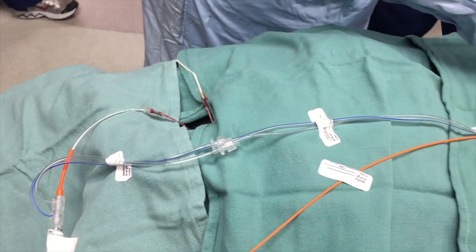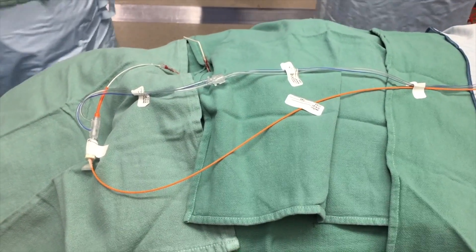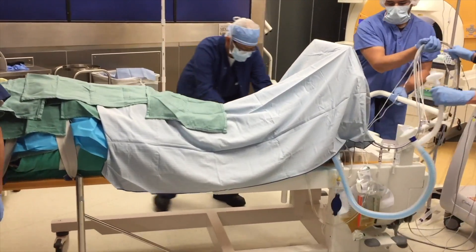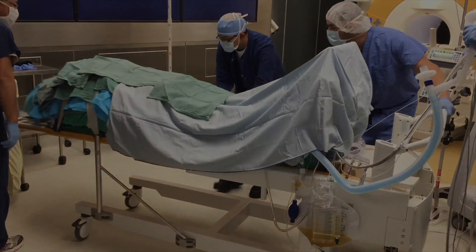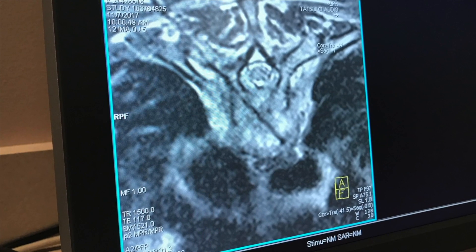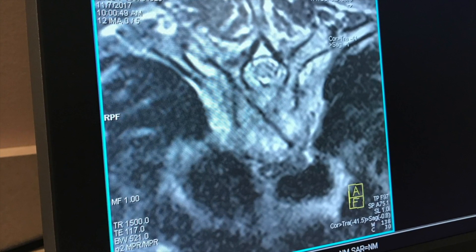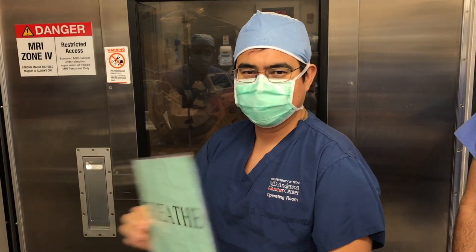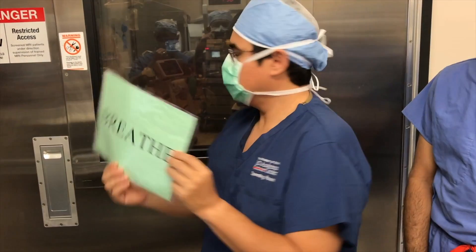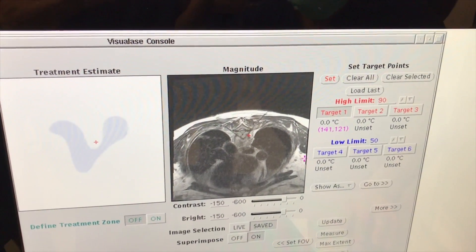For larger treatments with multiple ablations, we will frequently have a second laser fiber from the operative field for efficiency. The laser fiber can be readily distinguished on the MRI and its location is confirmed. MR thermography is then initiated, taking into account the patient's body temperature and with apnea during planning scans and thermography, strictly avoiding hypercapnia of greater than 45 millimeters of mercury, using visual signals between the surgeon and anesthesiologist.